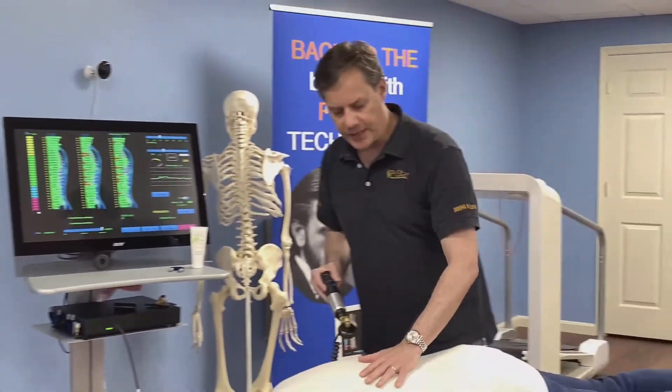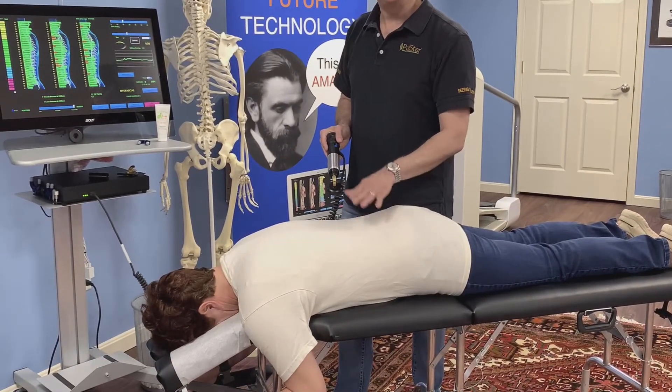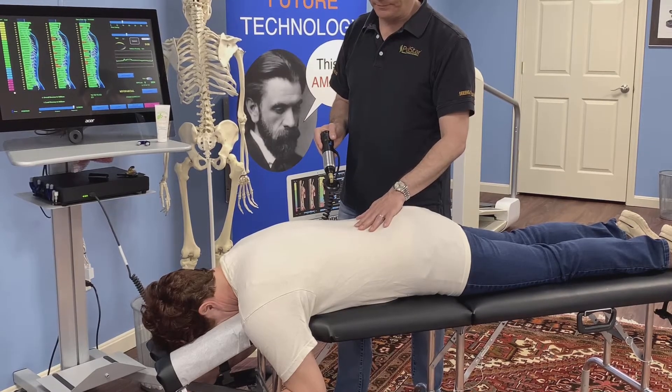I'm going to try to relax Danielle's muscles on either side of the spine just very quickly, and you can do this before or after the adjustment, just like you would with a massage therapist.